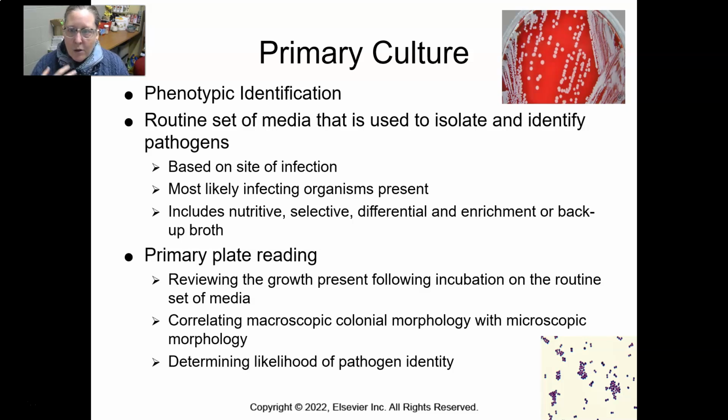And this is all driven by the most likely infecting organisms present. You should usually include some kind of nutritive media, some selective and differential, and enrichment or backup broths. So a combination of all of these to catch all the most likely organisms.